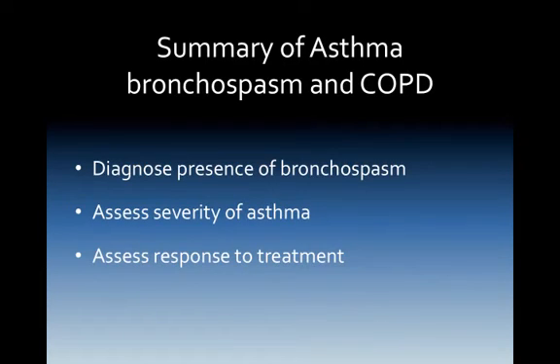Summary of asthma, bronchospasm, and COPD. Diagnose the presence of bronchospasm. It helps with that. It gives us a nice shark fin appearance instead of a nice flat, elevated plateau. It assesses the severity of the asthma and assesses the response to treatment.